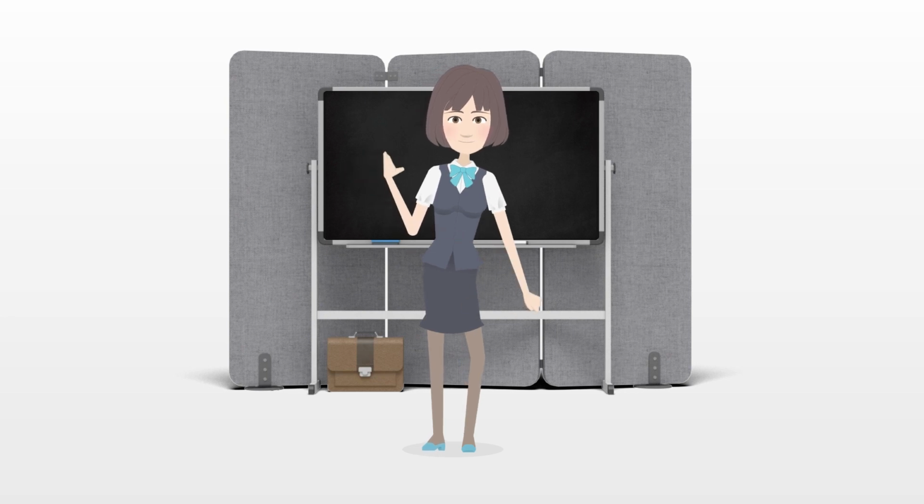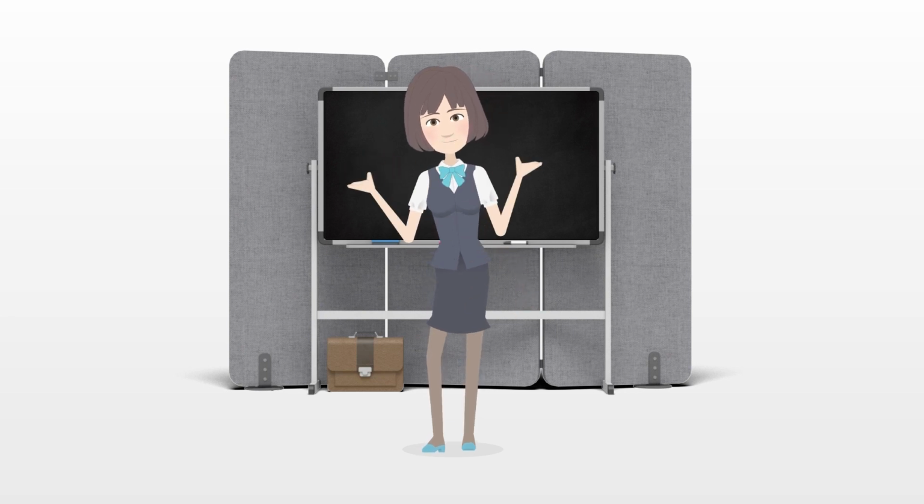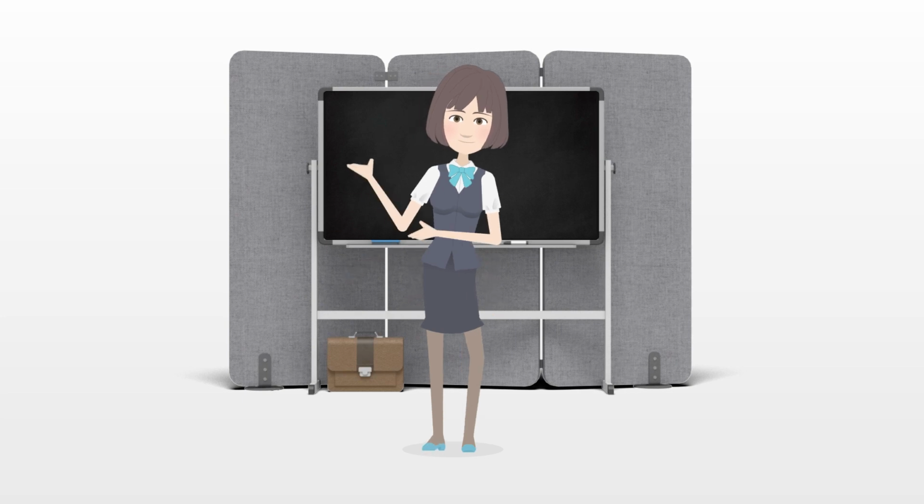If you are concerned that the pressure setting isn't right, consult your doctor again to see how you can rectify it.